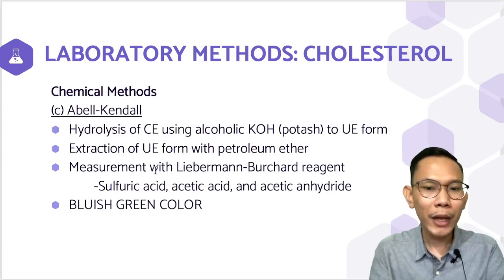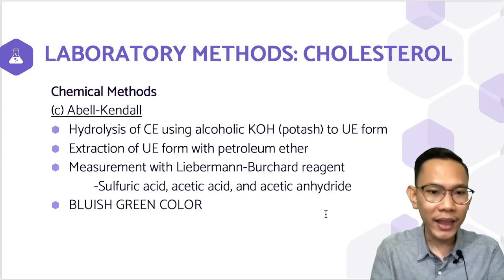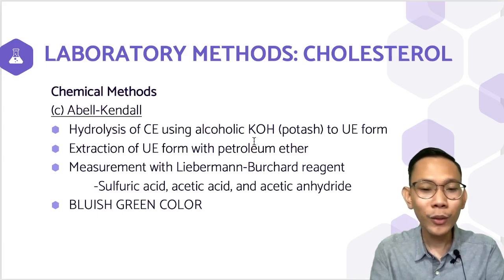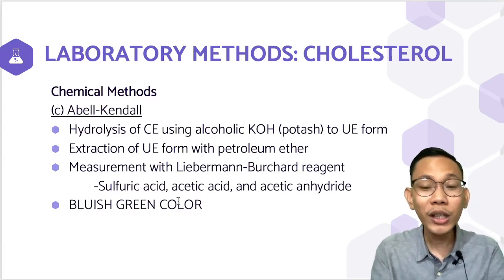Again, what is the composition of our Lieberman-Burchard reagent? We have sulfuric acid, acetic acid, and acetic anhydride. Since we are referring to a Lieberman-Burchard, the positive result here will still be your green or bluish green color that would indicate the presence of your cholesterol.